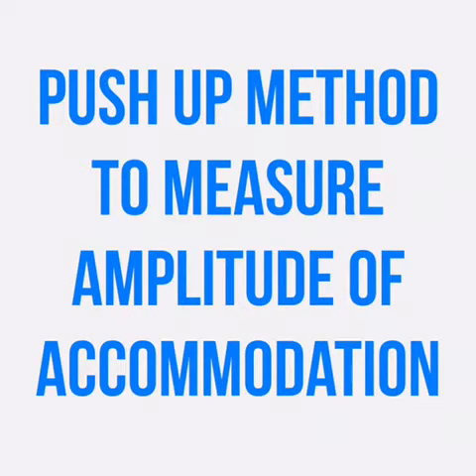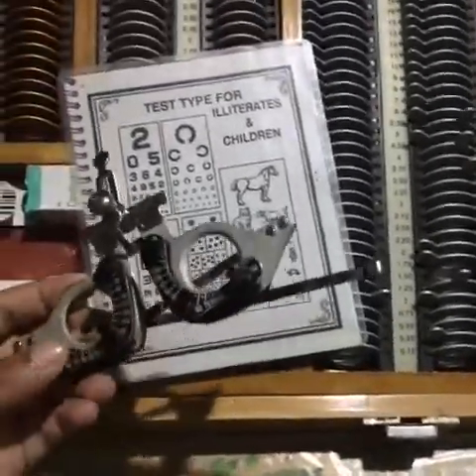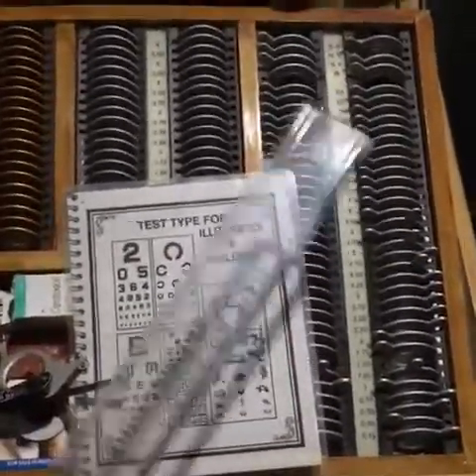Hello everyone, I am going to discuss how to measure amplitude of accommodation using the push-up method. So let's begin. For this test we need a trial frame, a near vision chart and a scale.